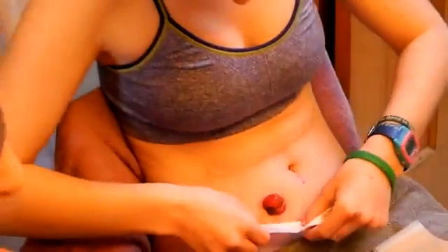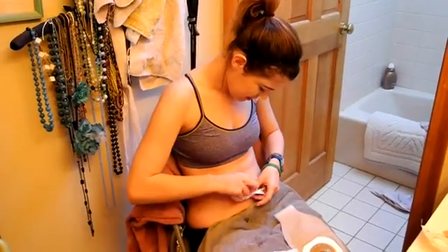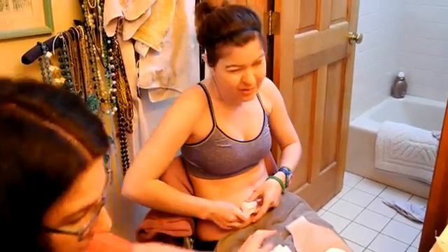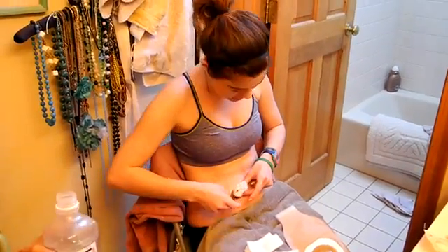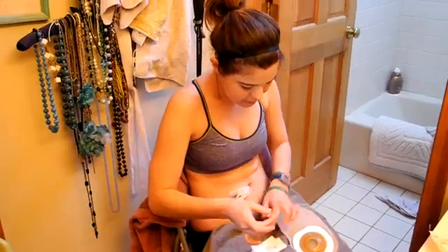It's really important. I know it gets really frustrating, but if your stoma is leaking, it's really important to wipe that skin away with saline because just leftover stool residue on your skin is very irritating. You can kind of see that there's still a little bit of red where I had my leak last time. Okay, so wipe some stool off of that.